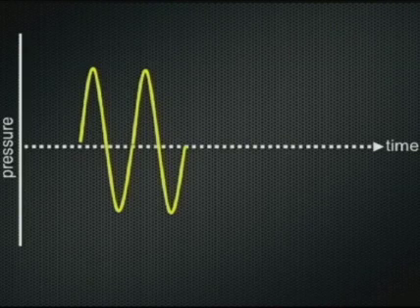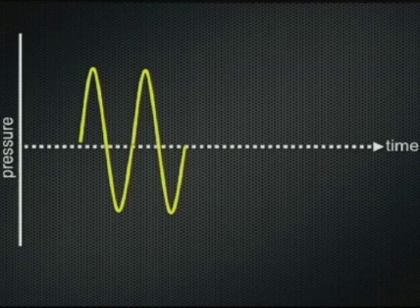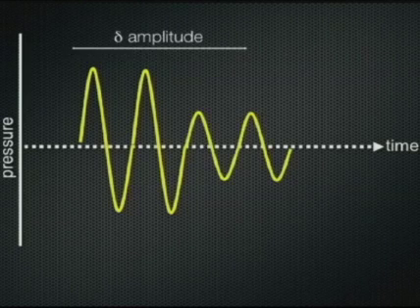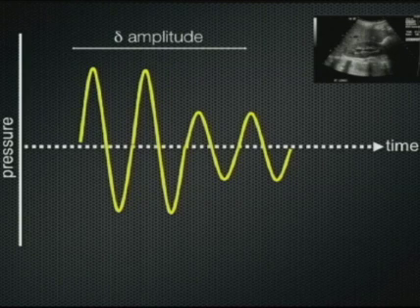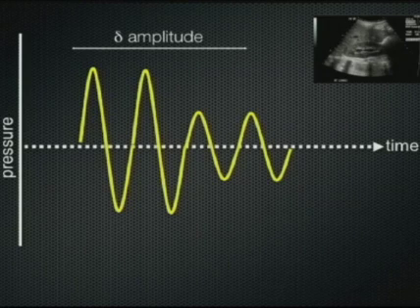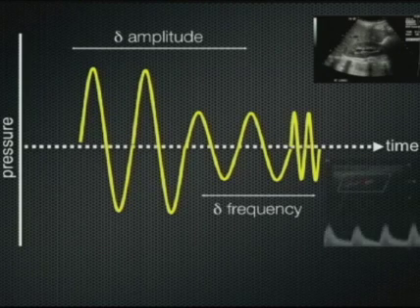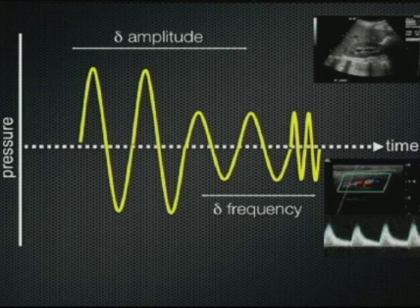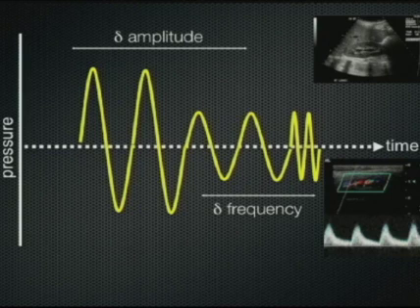Ultrasound, of course, is pressure waves that are transmitted through matter. We can depict these as alternate areas of increased and decreased pressure that move through tissue over time. The ultrasound image is based on differences in the amplitude of the backscattered echoes reflected from interfaces within the body. But the backscattered ultrasound signal also contains information related to changes in frequency of the backscattered ultrasound signal. And this difference in frequency provides us information used to evaluate the presence of blood flow, its direction, and velocity.